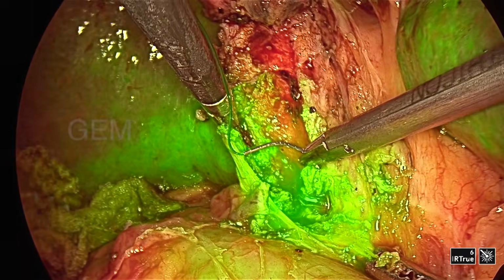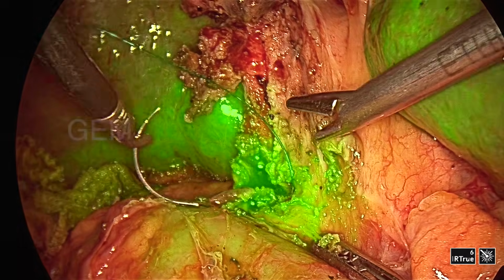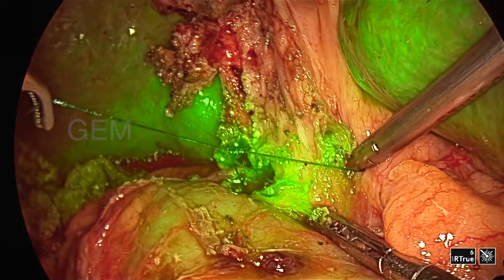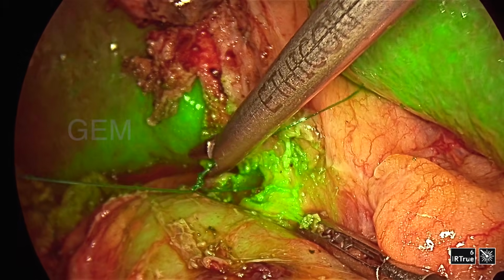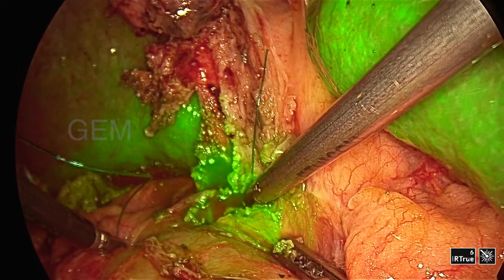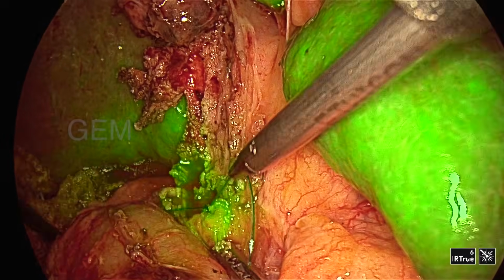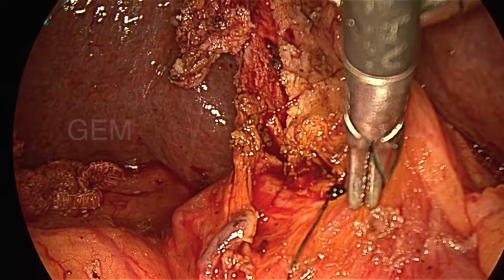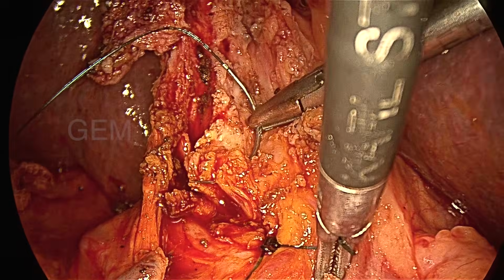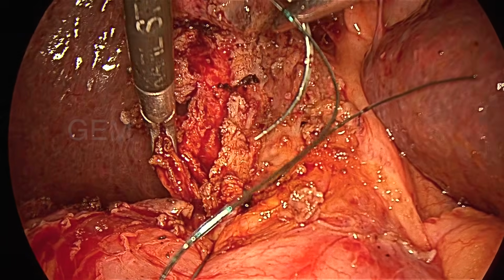I am taking the PDS, Maxon PDS. So I started suturing the cystic duct at the level of the CBD, that is the cystic duct CBD junction, and you can see how much I divided. It's almost 5 to 6 centimeters down. I come down and then I take down the stone. You can see the turning out of this cystic duct. It is turned medially. That area the stone was there. I removed it and then I started suturing it.